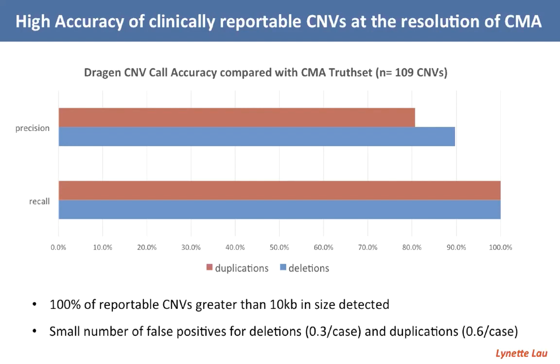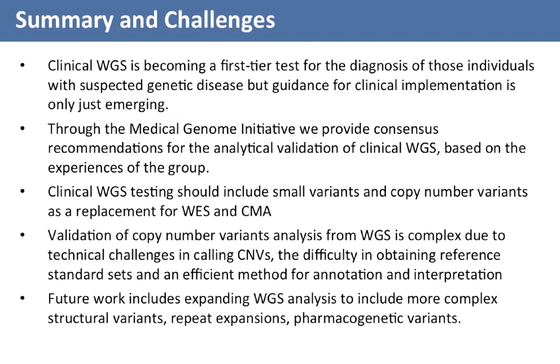So this is really important because obviously one of the challenges is once you have your CNV analysis, you need to make sure that you have high precision so that you're not chasing up a whole bunch of false positives. So that's a really quick overview of what we're doing at SickKids.